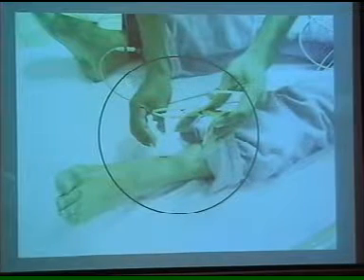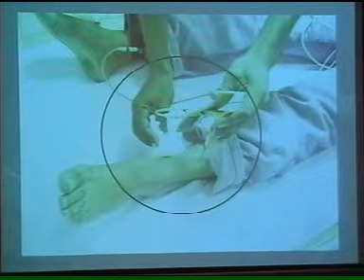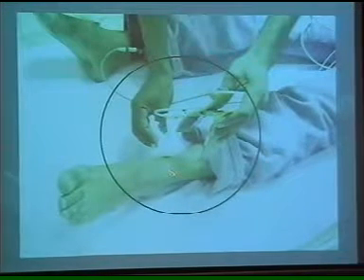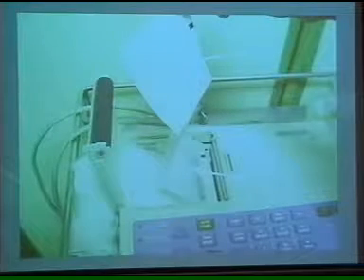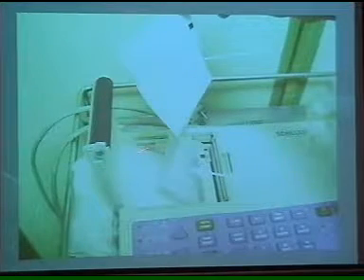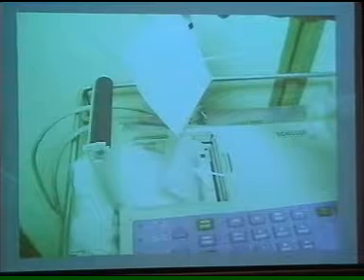Then once you do the ECG, either manual or automatic machine, you must clean the patient because you have put the electrolyte jelly on the patient. You must also check that there is adequate paper in your ECG machine from time to time. Then you can take care of your leads by hanging them in a secure place.